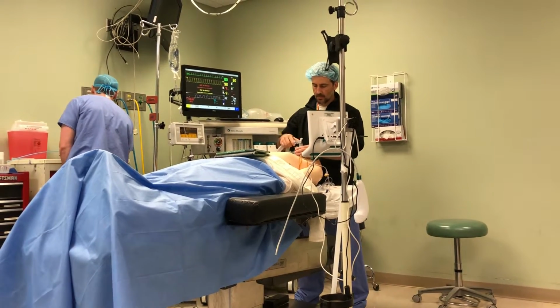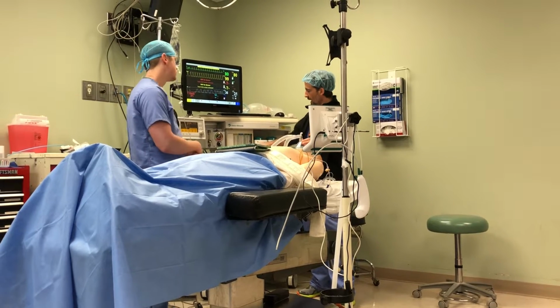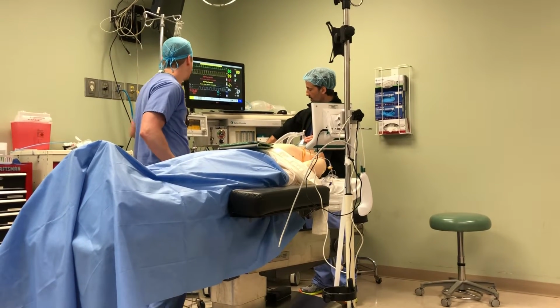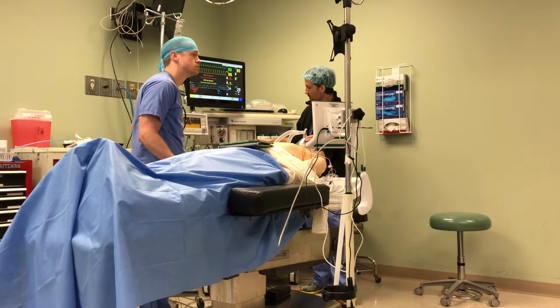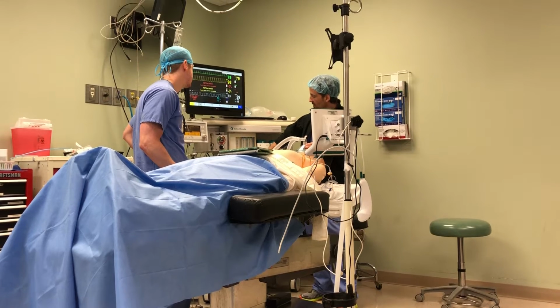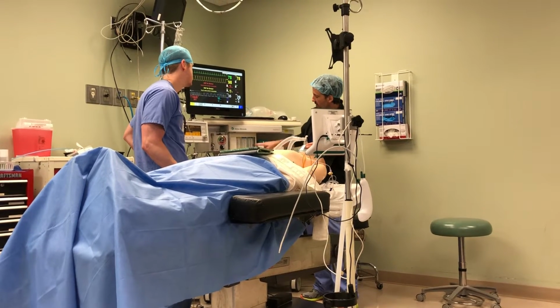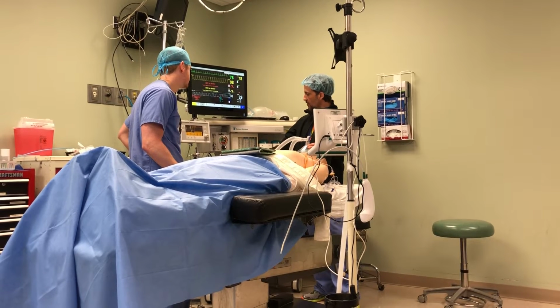How many liters a minute is 100%? Good question. Anything. I can have it down to 2 liters a minute, and that's 100%. Because all you're getting is pure oxygen. So it's not liters based, it's based on what's coming out. So when it's only oxygen, the liters are irrelevant, all of this is 100%. When I start mixing in, that's when we start getting 50% O2, 60%.